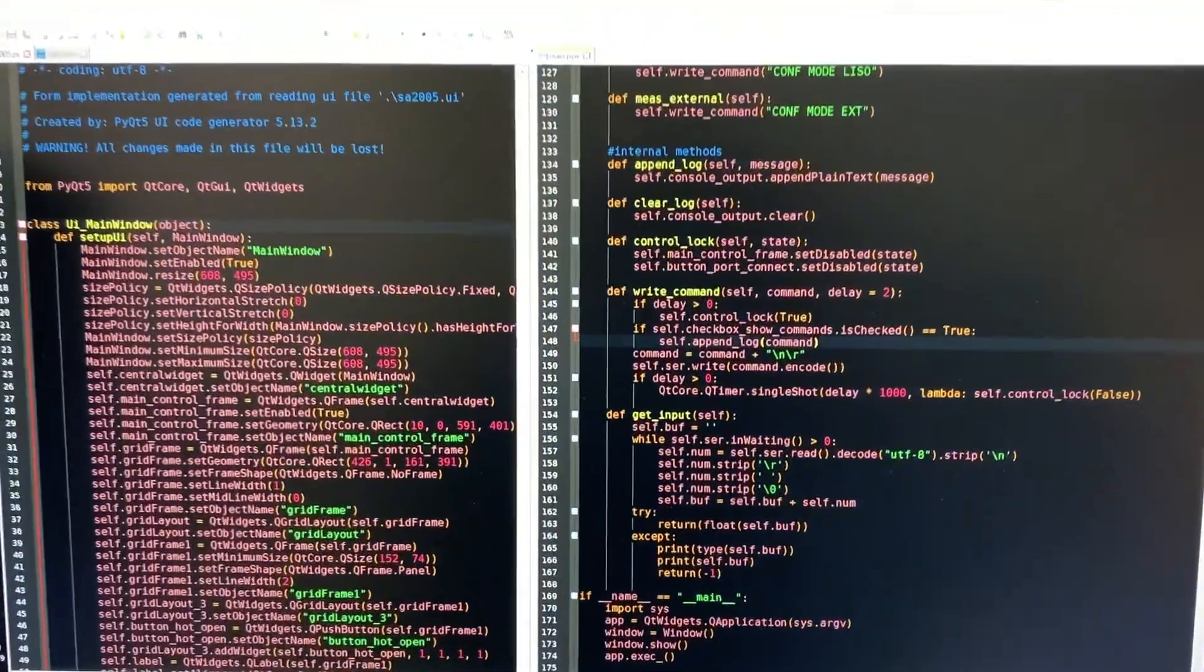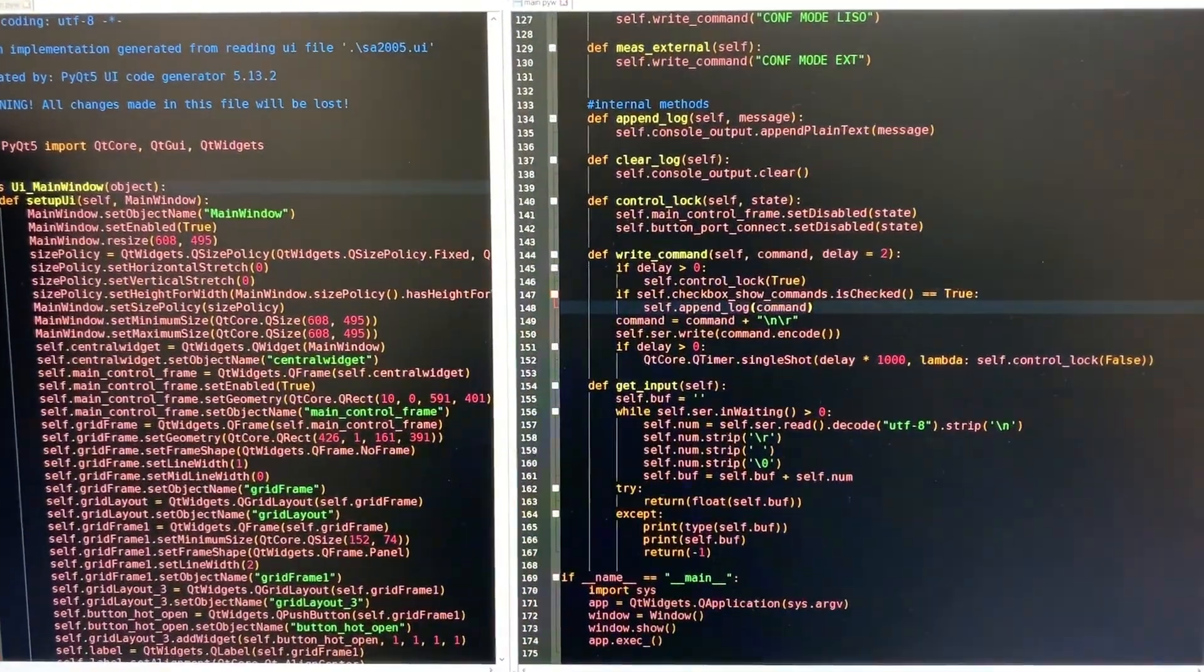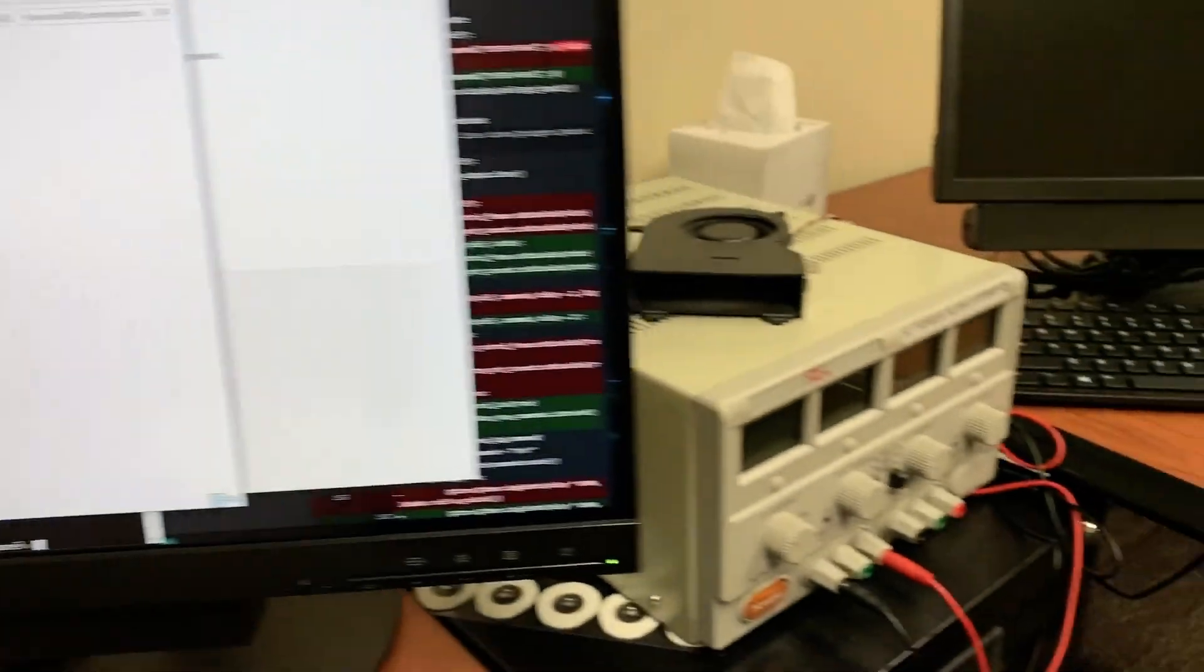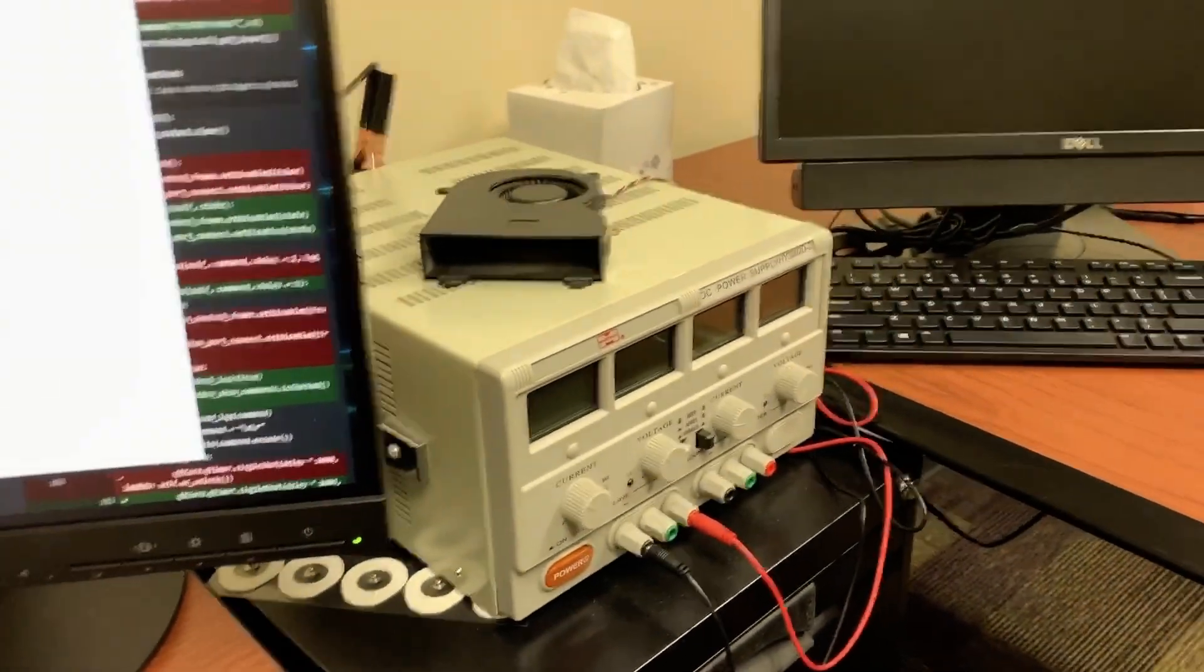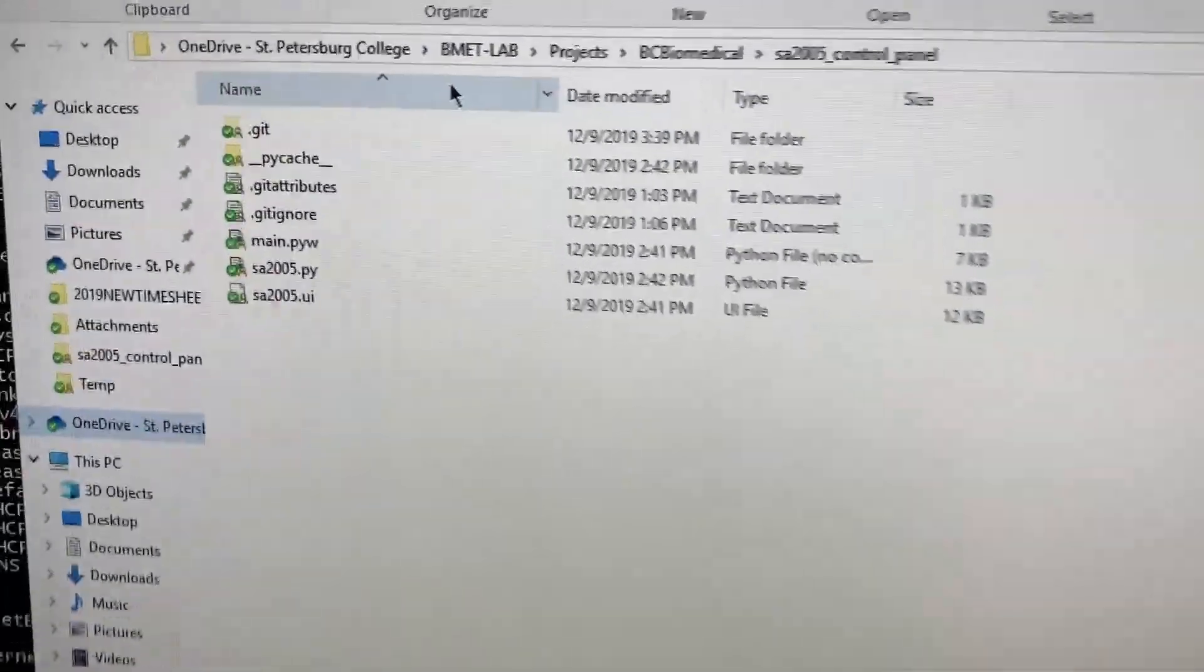But to improve on that, I added a bit more code to create a graphical user interface using the Qt library for Python.